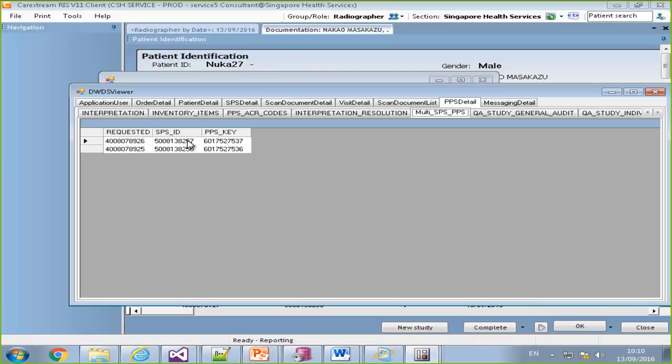But again, the two features we're showing you this morning sound really easy, but under the hood there's a ton of stuff the team had to think about. They've done a good job of handling a lot of potential risk as well. There absolutely is, and that's why we highlighted it on the core call, particularly this one, where the documentation window is going to be discontinued in 11.3. You've probably got a year to put them in there and make sure everything's working properly, maybe a year and a half.